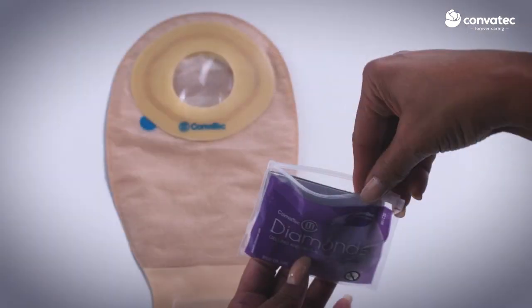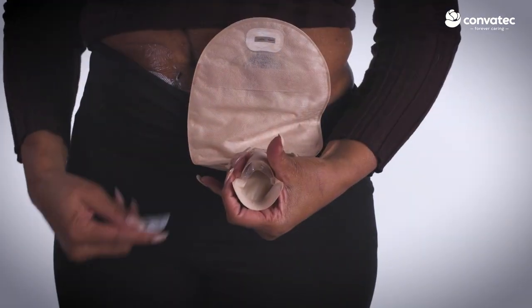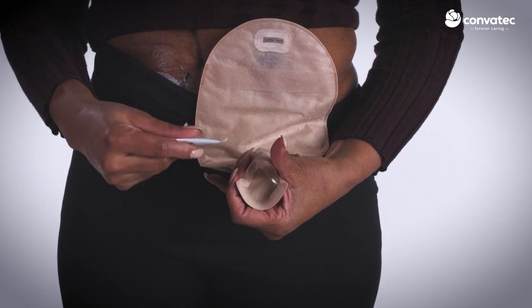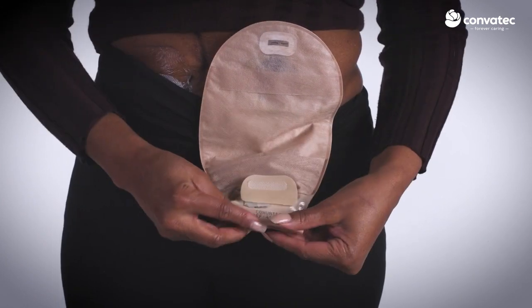To use, do not tear or open the sachet. Place the entire sachet into the pouch through the base plate opening prior to use, or through the drainable pouch outlet. Close your pouch as normal.